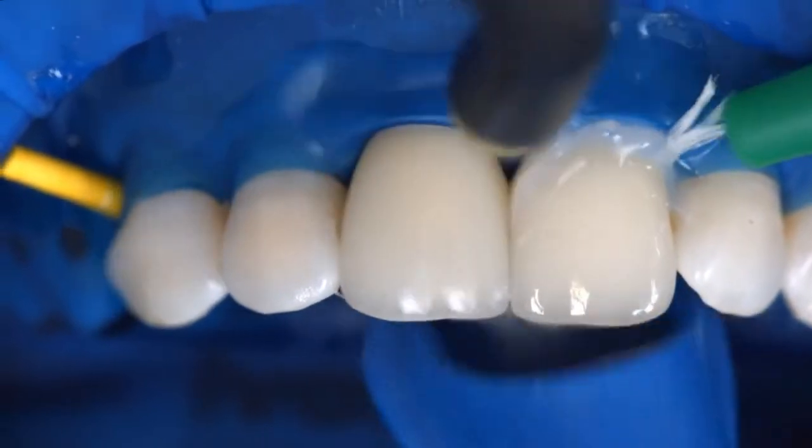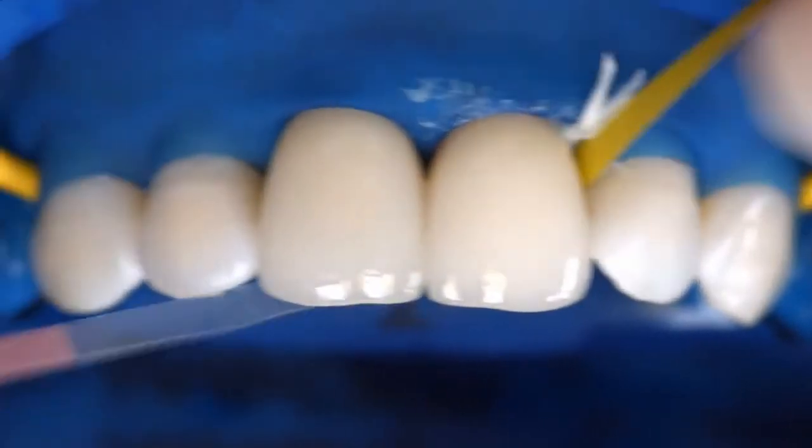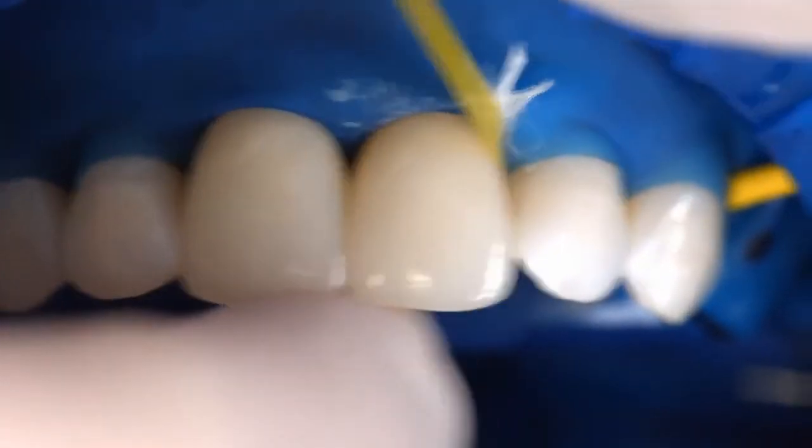Rinse off Liquid Strip. Finish the proximal surfaces using finishing and polishing strips.